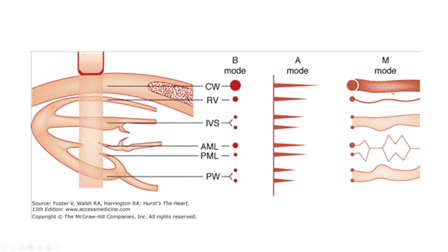The structures seen are: chest wall, right ventricular free wall, right ventricular cavity, interventricular septum, left ventricular cavity. Here you see the motion of the anterior leaflet of the mitral valve, the motion of the posterior leaflet of the mitral valve, and the posterior wall. The M-mode echocardiogram shows the motion of these structures throughout the cardiac cycle.